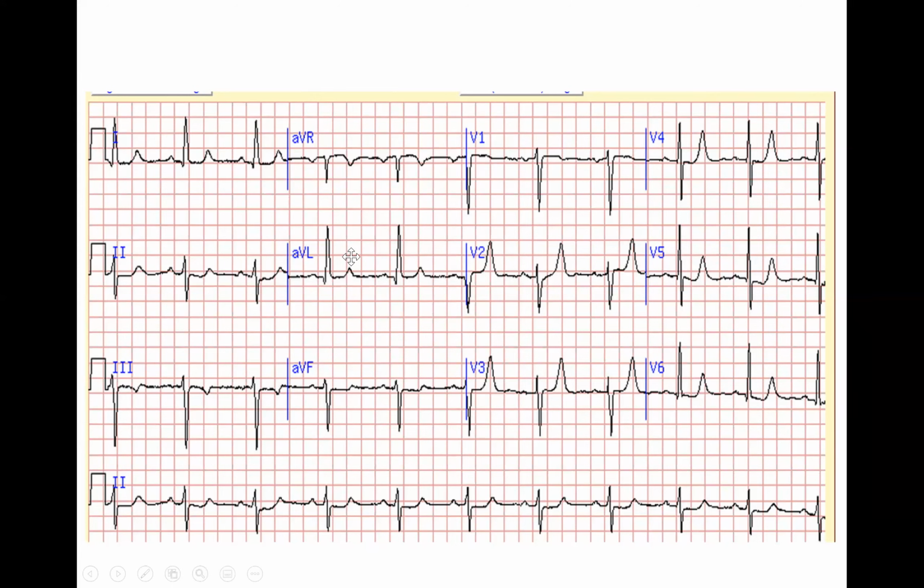Just to add on that, with LVH and heart failure, it is more common to see left atrial enlargement. So always when you have an LVH with LV strain, look for left atrial enlargement. If you look here, the P wave is bifid. It is wide, more than 3 millimeters, and the second deflection is more than 1 millimeter in depth and in duration. So this also favors left atrial enlargement, in addition to the left axis, LVH, and also the hyperkalemia because of the tall, tented T wave.